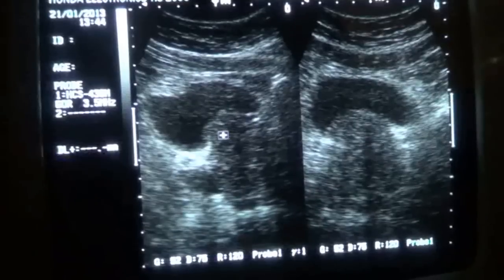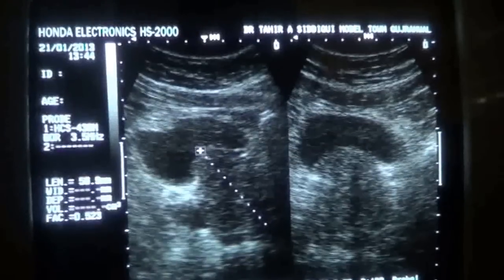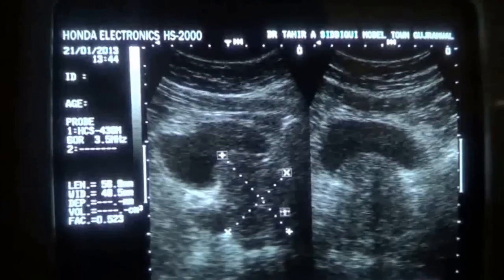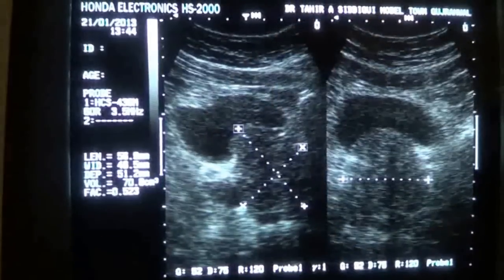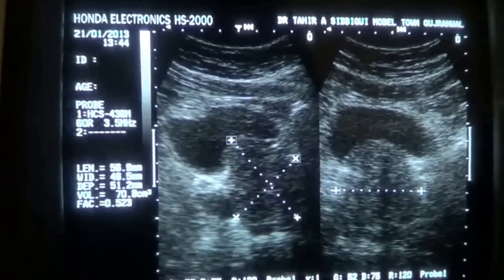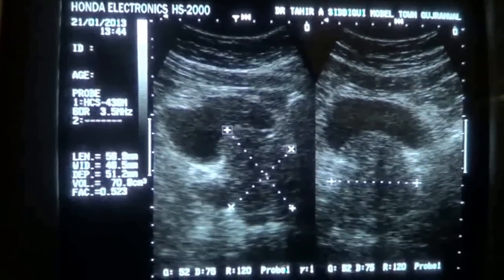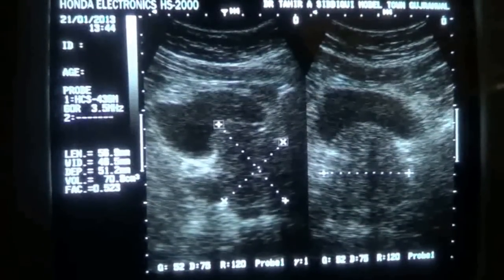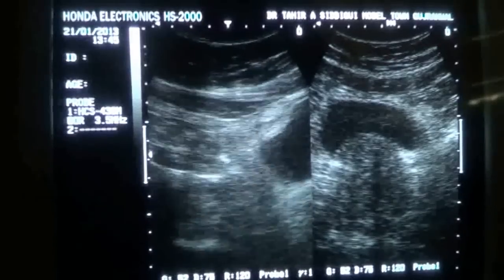This is the longitudinal view of the prostate. It measures 5.6 cm by 4.6 cm by 5.1 cm, and its weight by these parameters is 70.8 grams. The prostate is enlarged — it should not exceed more than 40 grams. This prostate measures approximately 70 grams.